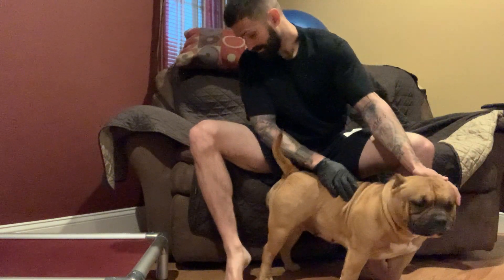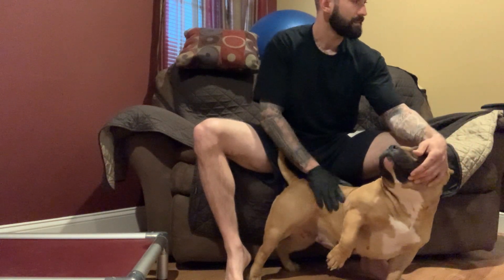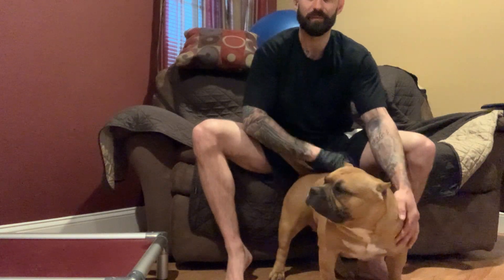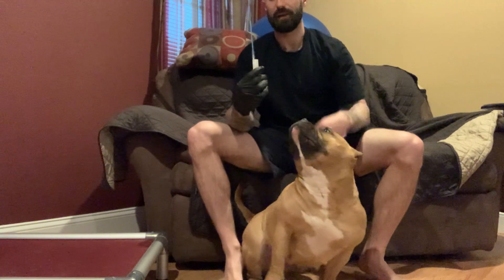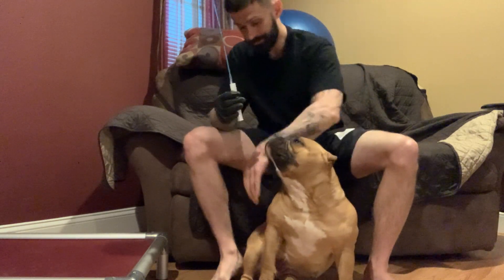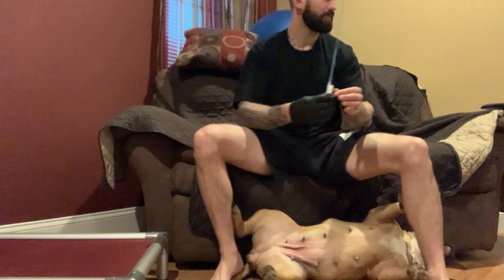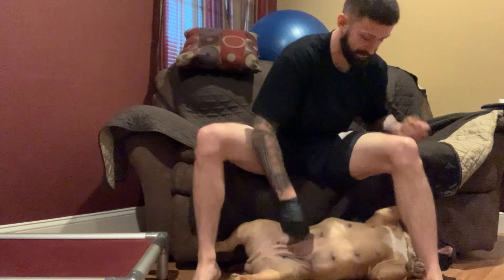Her levels are still low — I'm assuming they're gonna spike over today and tomorrow. To do an AI, you grab the female. She just flopped! Hold on, what are you doing, silly?